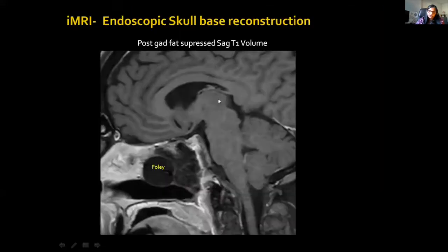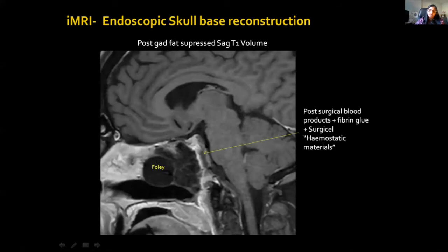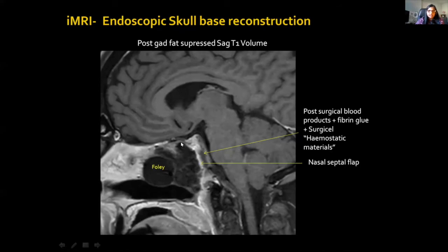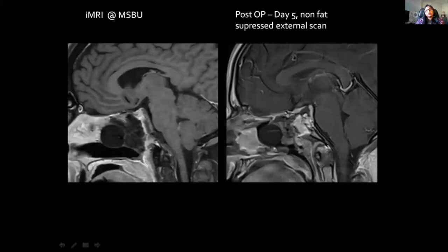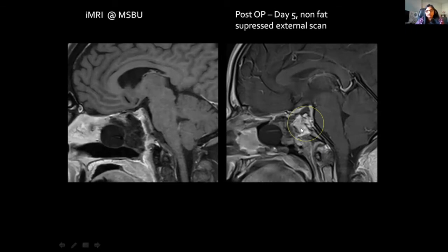Coming to the post-operative imaging: a sagittal T1 sequence demonstrates the different layers of reconstruction. Going from in to out, we have an area of low T1 signal with some high T1 signal — a combination of blood and haemostatic materials — then the enhancing nasal septal flap, followed by spongiostan and the nasal Foley. Comparing with a reconstruction done at an outside hospital, the layers are different and fat has also been used. It is important that when fat is used, fat suppression sequences are employed, as otherwise it can be difficult to distinguish where the flap ends, the fat starts, and whether there is any residual tumour.